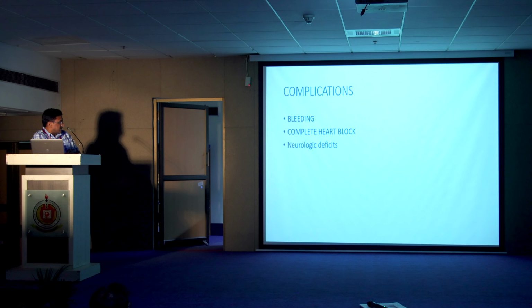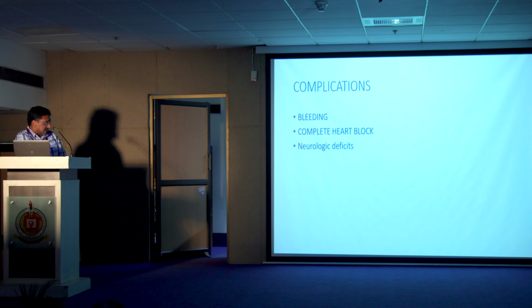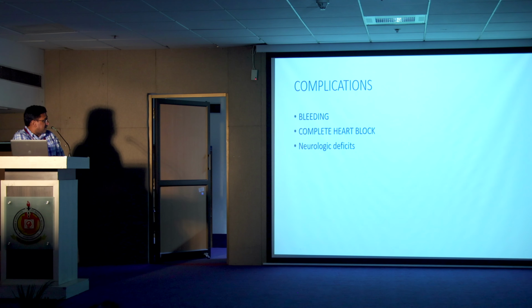Complete heart block is one of the complications when you are doing an overzealous decalcification, or sometimes calcium is there and you have to remove it, otherwise you have insecure sutures. It can't be avoided sometimes. That's why it's better you come off with the 2 pacing wires.